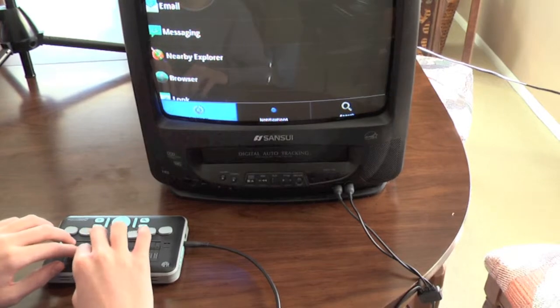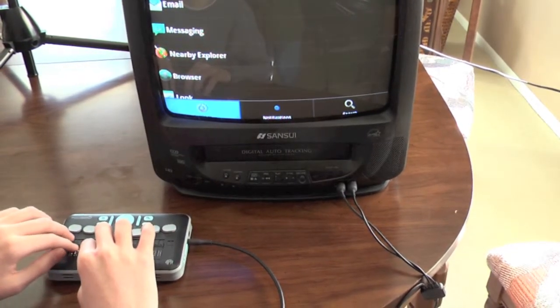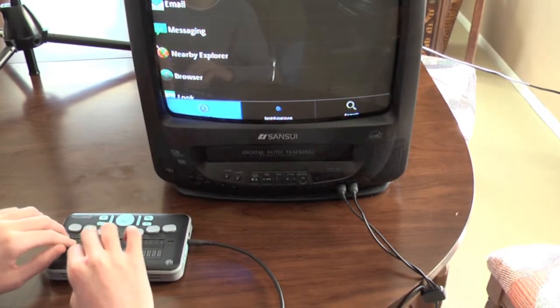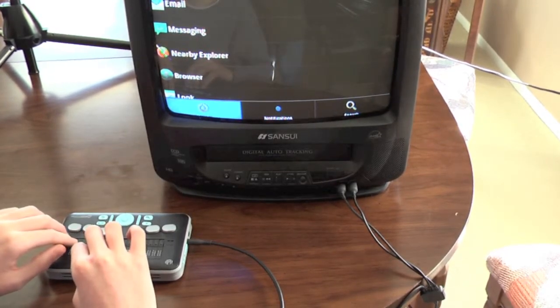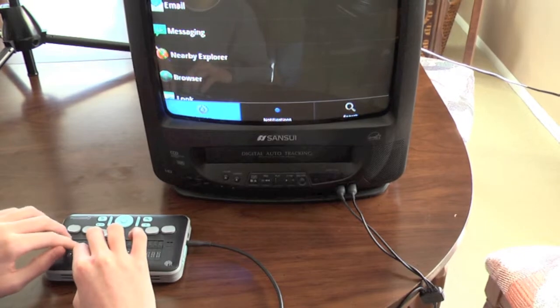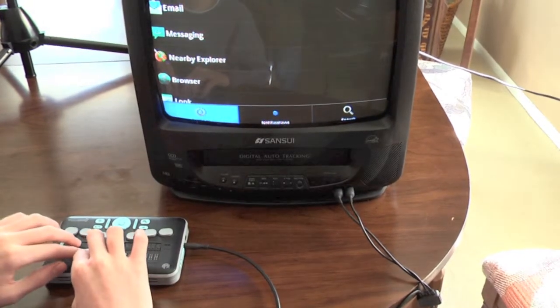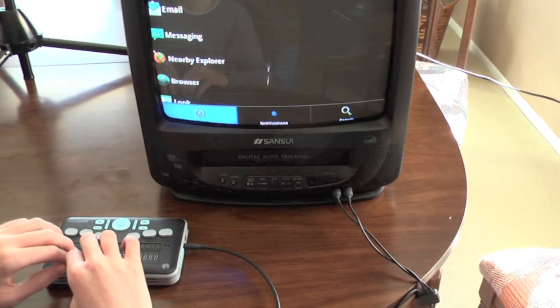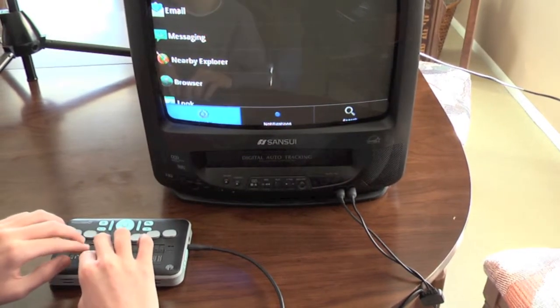The home screen, like many other applications on the Braille Plus 18, contains a menu with further options related to the program. In this case, we have 3 options, but in other applications you will have more. Here, the first option is Settings, which will open the Settings application, which will allow you to set settings for nearly every application on the Braille Plus.